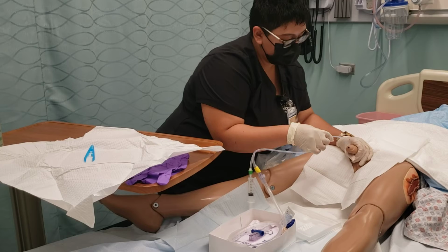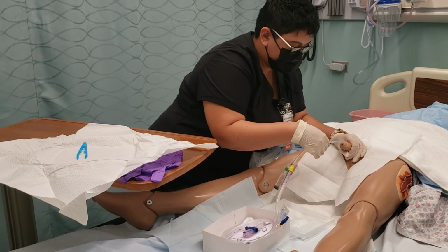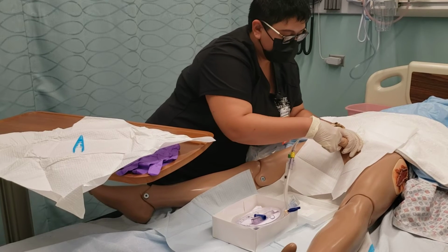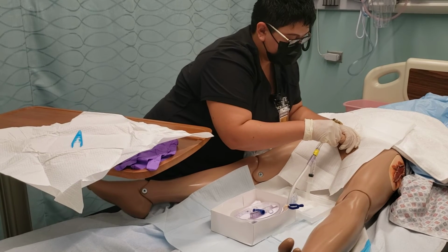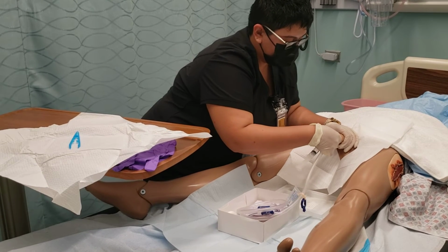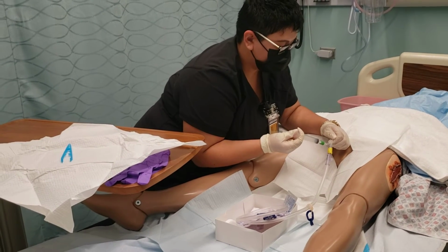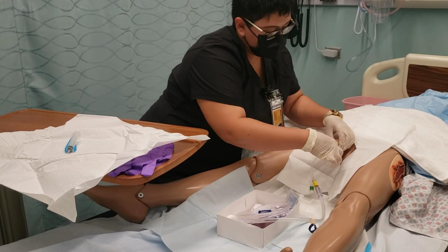Okay, Mr. Williams, I'm going to just insert the catheter, okay? Should feel just a little bit of pressure. Okay, and I'm going to insert the catheter slowly. If I meet resistance, I will turn it. And normally I'd be able to put it up to the Y of the catheter. However, I don't think that will happen today. Actually, oh, look, perfect. So now I'm just going to hold it and inflate the balloon with my saline. And then we'll pull until resistance.